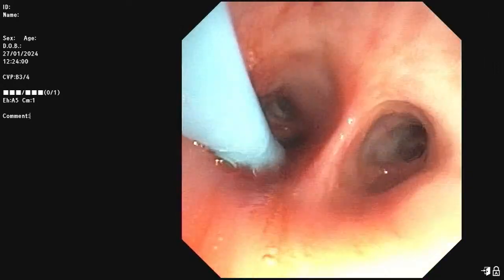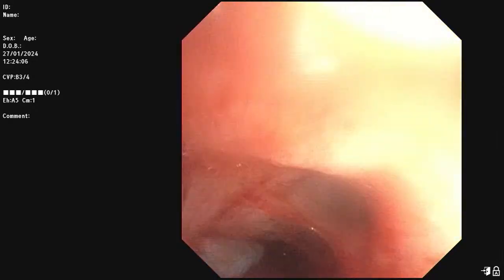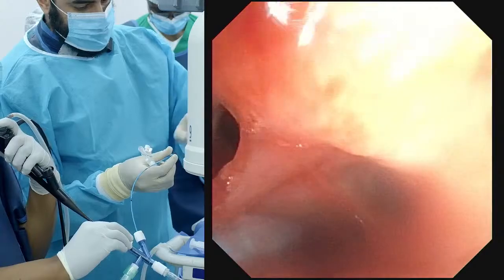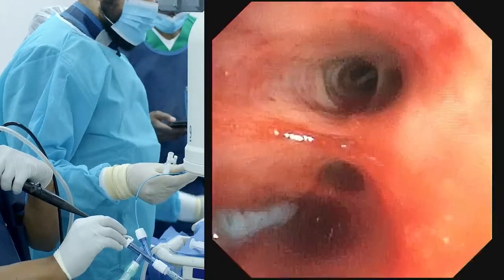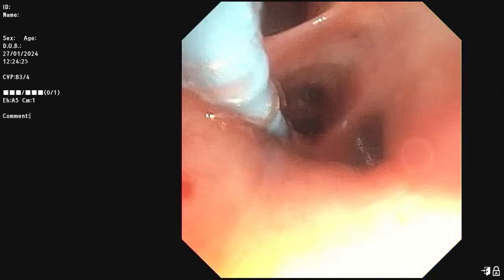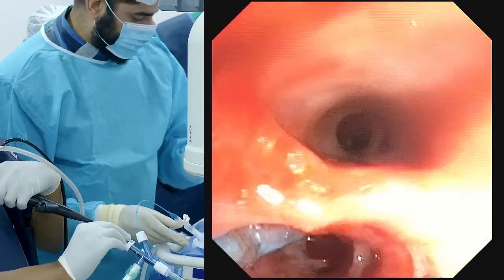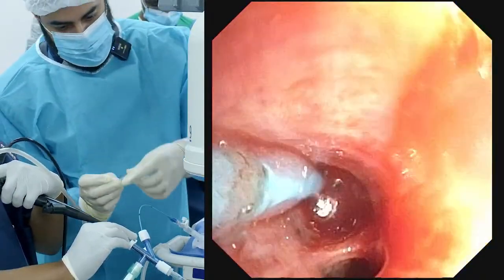You're still in the same nice place. What I'm going to do is pull the balloon out a little bit and inflate it here. That way you can take from any one of those. Let me pull the guide wire out. Let's see where the balloon is blocking. Yeah, you're good, the balloon is good. So I'm just going to keep the balloon in place, and then you can take your specimen from any one of the segments you want.